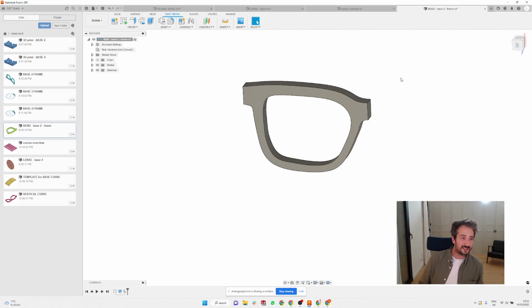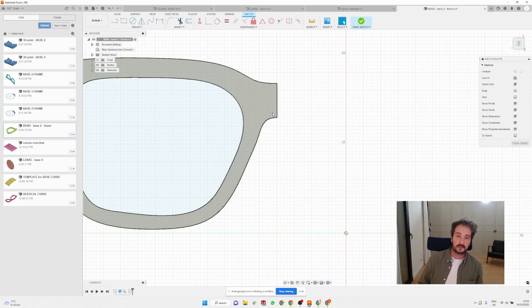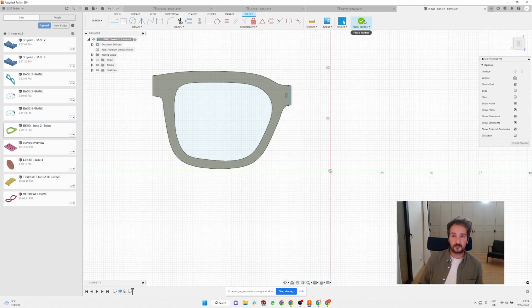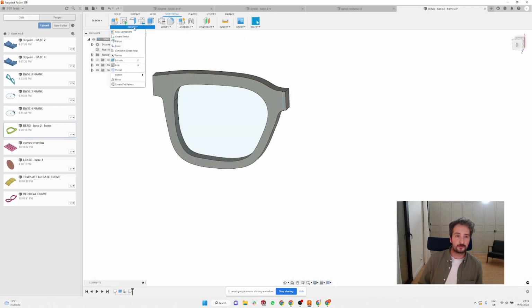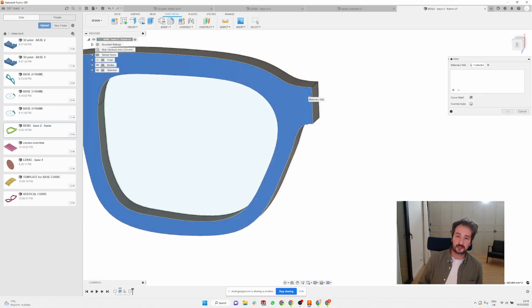What I realized is that Fusion doesn't allow me to do two bends at the same time. So I can just make the curve which is horizontal. I cannot make the cylindric shape of the lenses, but it can still show you a little bit how this can look. So I'm going to create a sketch on the top of the frame, and I'm going to make a little vertical line really close to the center of the frame. At this point I can finish the sketch, and go again to Create and go to the function called Bend, and now it's asking me what I want to bend. So I'm going to click on this small bit.